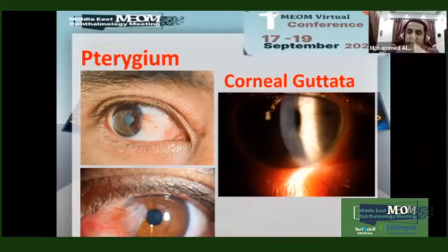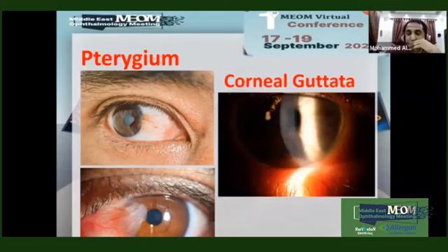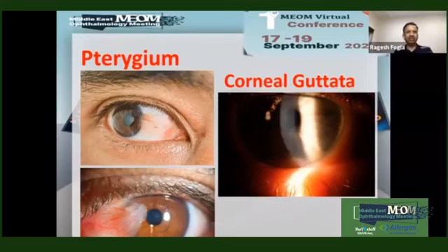So you will start with pterygium, then wait after? Yes, I'll do a pterygium surgery first and then follow with a cataract surgery. For how long will you wait? You can wait for a month. I think that's more than enough, until the surface is smooth and you find the astigmatism has no significance. You don't need to wait for a long period of time, because there are no sutures in the cornea, no cuts in the cornea as such. You just wait for the surface to become smooth and stabilize.